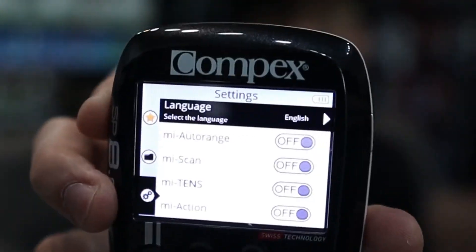Switch on your device, head over to the settings function — as you can see over here — and scroll down to pair a new module. If it's a new module that you just got from the shop, it should be able to pair seamlessly.